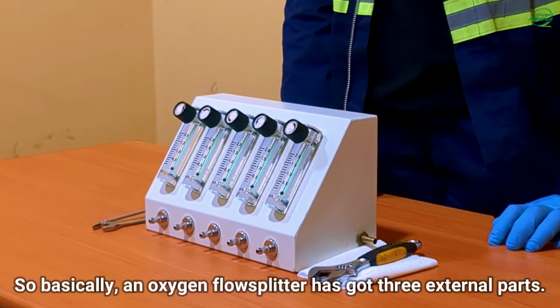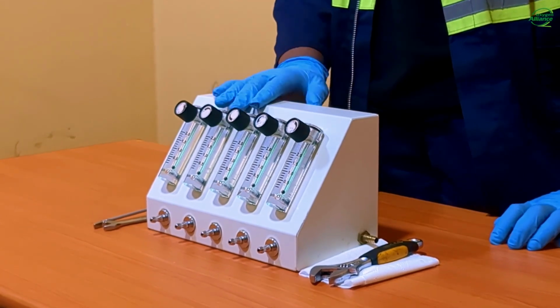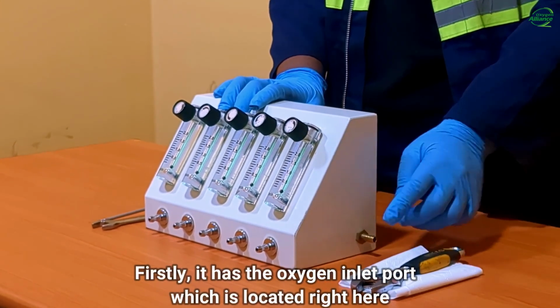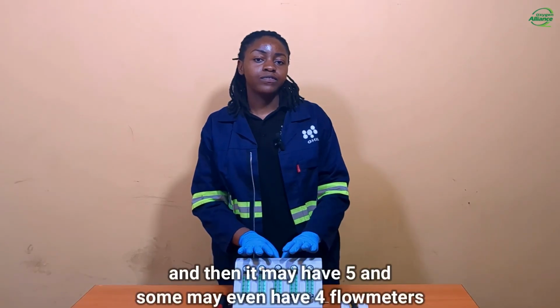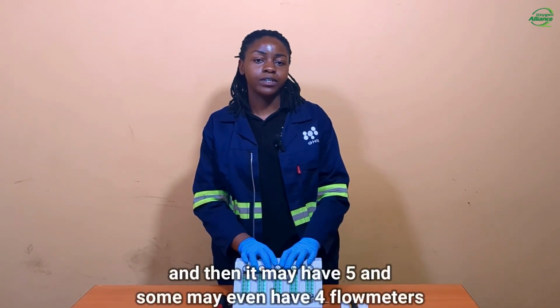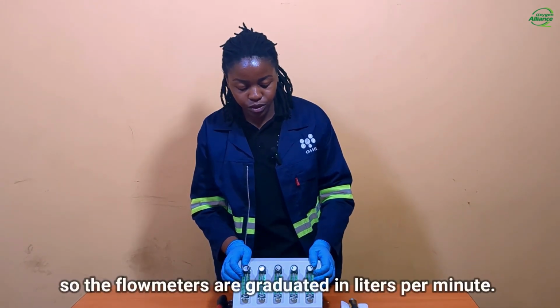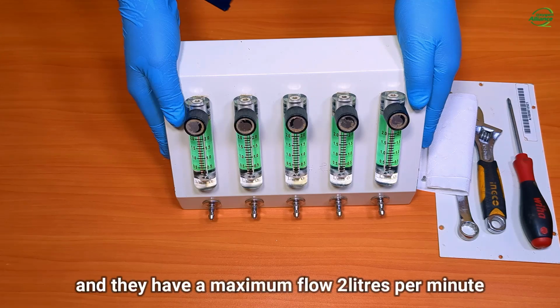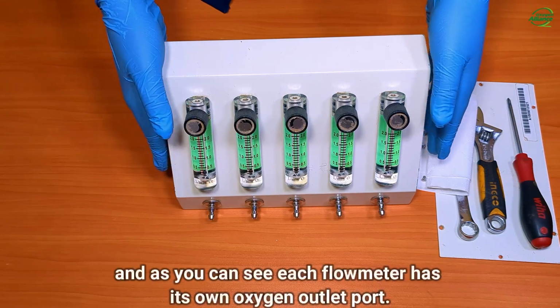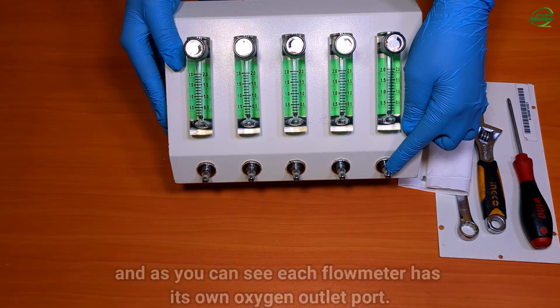So basically, an oxygen flow splitter has got three external parts. Firstly, it has the oxygen inlet port, which is located right here. And then it may have 5 and some may even have 4 flow meters. So the flow meters are graduated in liters per minute, and they have a maximum flow of 2 liters per minute. And as you can see, each and every flow meter has its own oxygen outlet port.